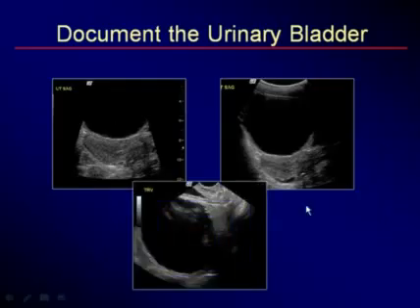With the transvaginal probe, as we scanned around, we tried to make sure that we saw the bladder, and we found the little corner. It's in the left upper corner of our picture, and this mass, we realized that this was an ovarian mass that had found its way anterior to the uterus and was not the bladder at all.